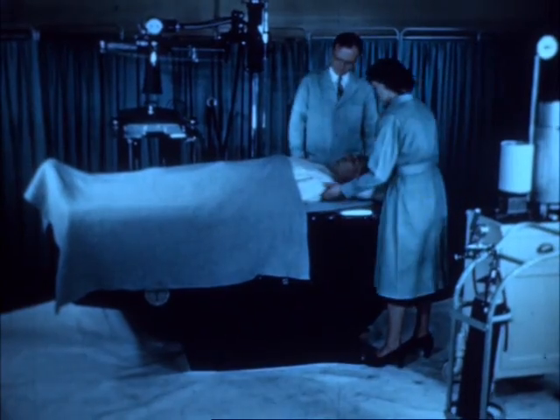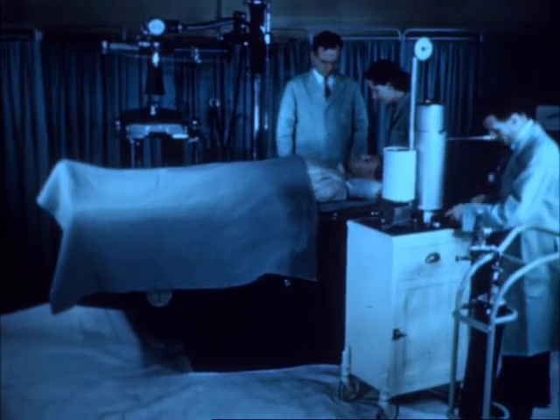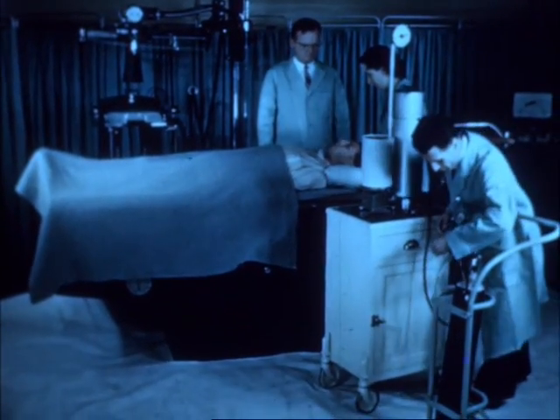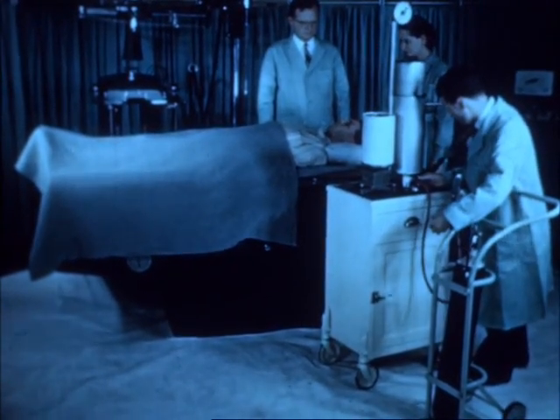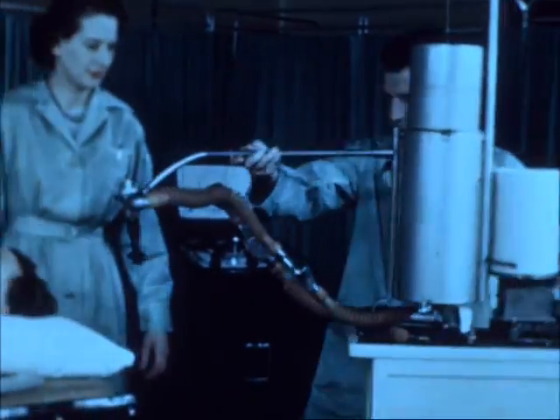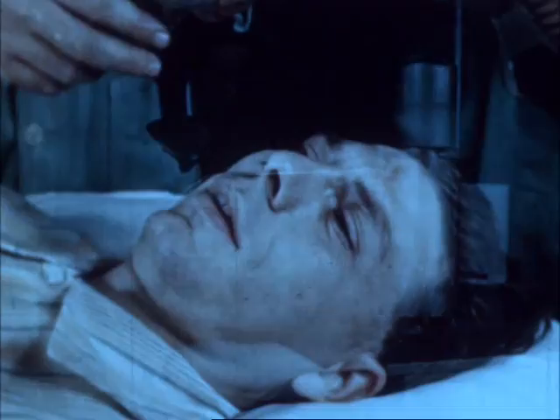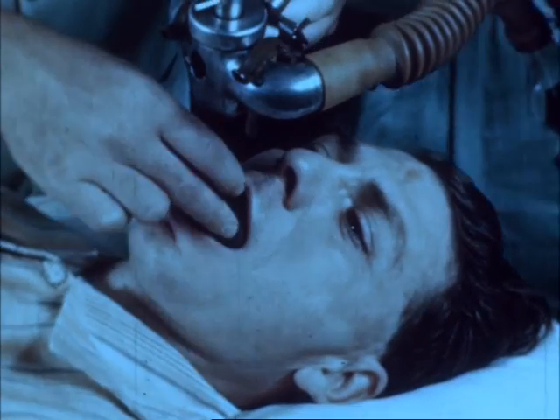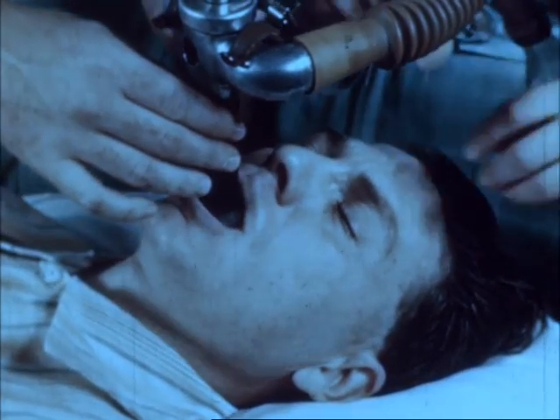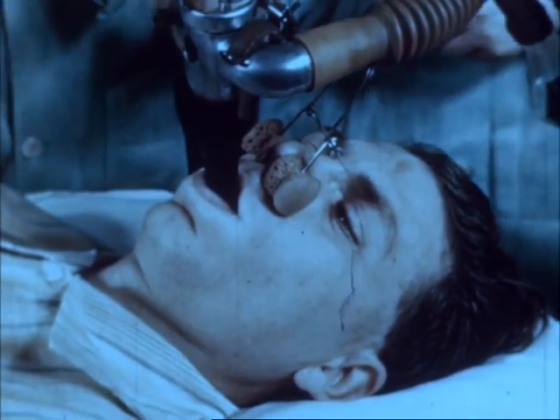In practice, the subject on whom the estimation is required lies comfortably on a padded X-ray couch. In order to measure his oxygen uptake, a spirometer is used, the air in the bell of which is enriched with oxygen from a cylinder. The spirometer mouthpiece is fitted in front of the subject's teeth and behind his lips, while the nostrils are closed by a comfortable sponge rubber spring clip to make an airtight connection.